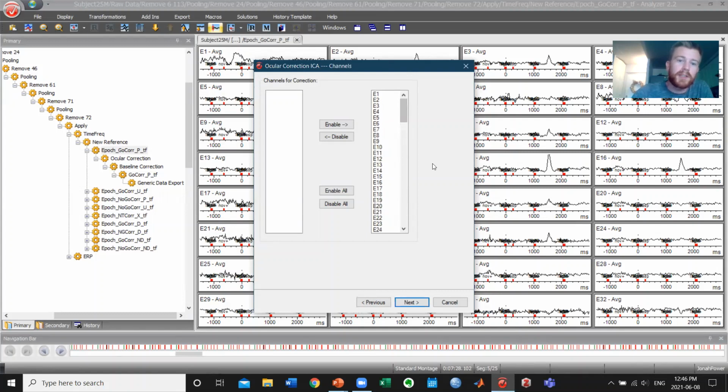Something I should note here is that when we do independent component analysis, the number of sources, so the number of components that we can actually identify, is dependent on how many spots we recorded from. If we recorded from 128 channels, then we can use a maximum of 128 components. There's one assumption, that those components are independent from one another.